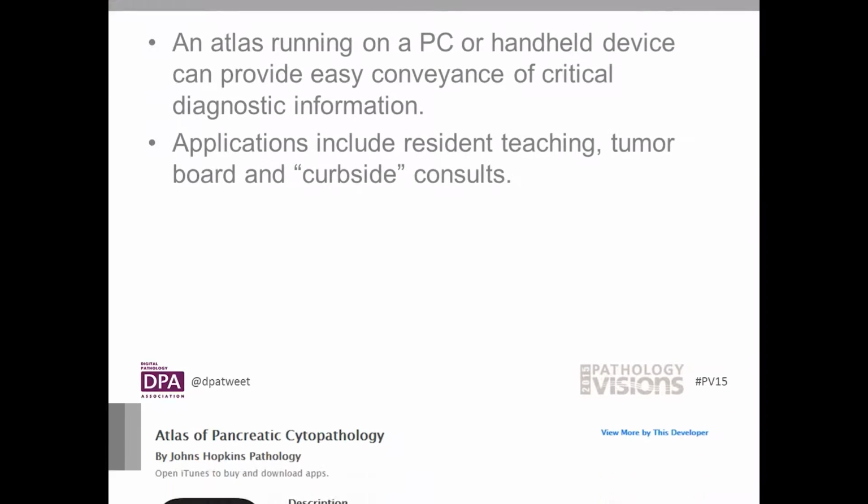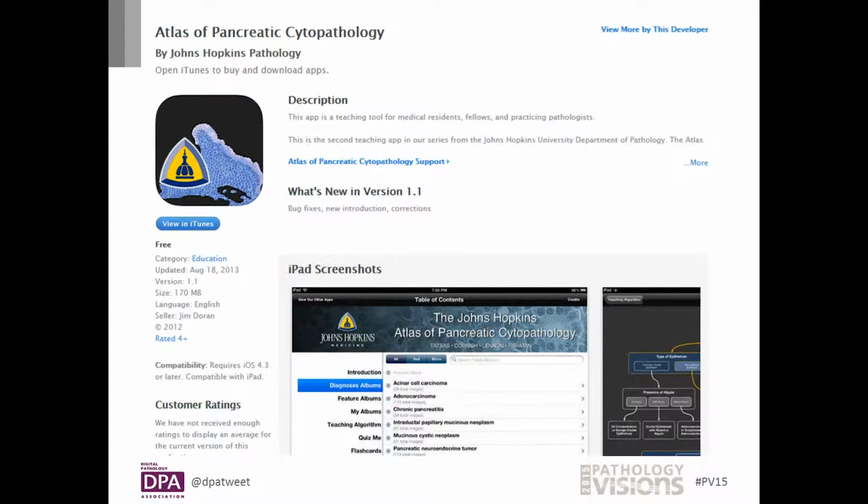How many of you have used or heard of this app produced by Johns Hopkins before? I found it to be incredibly helpful when learning cytopathology. It organized a variety of pancreatic cytology images by diagnosis and was easy to navigate. Most important, it was free.